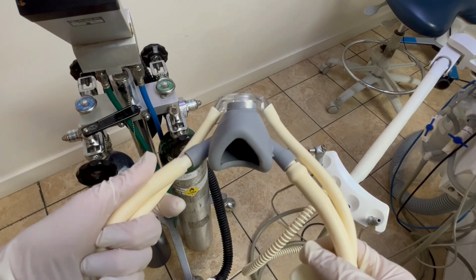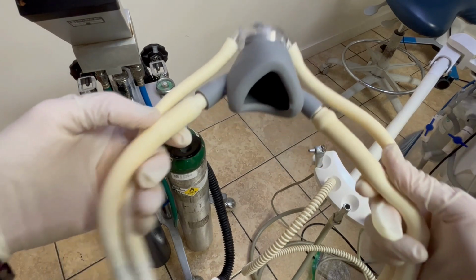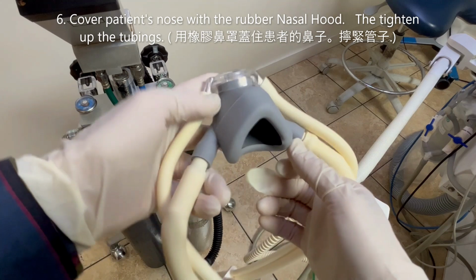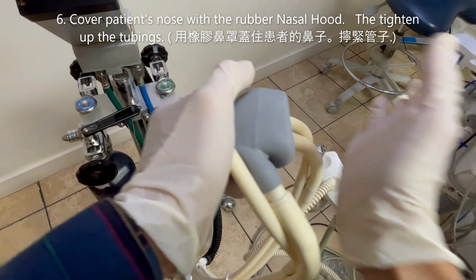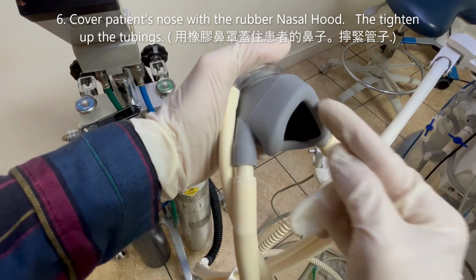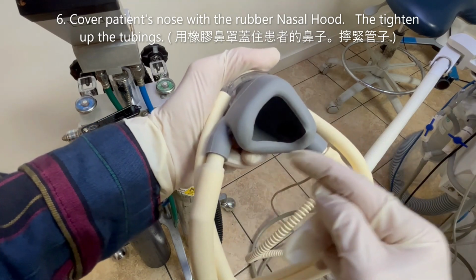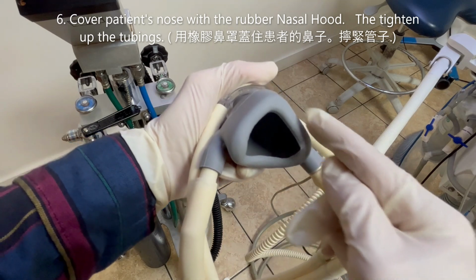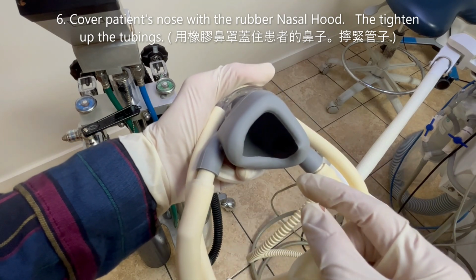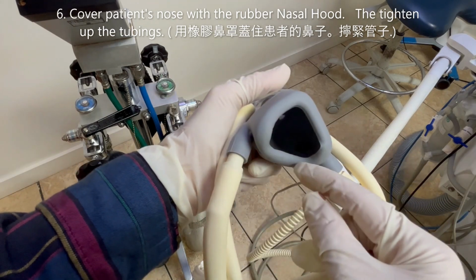Once that part is done, put the nose piece onto the patient's nose properly. Make sure you have a good seal. When you put it on the patient's face, make sure you get a nice seal around the nose. Typically, this just covers the nose. It is not to cover the mouth. For children, we have another smaller size of nose piece that will cover the nose.